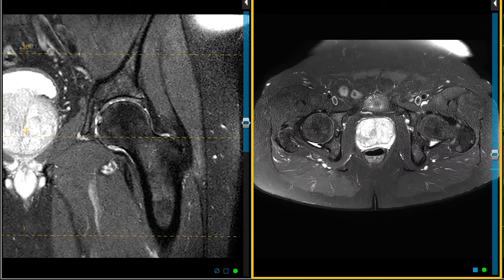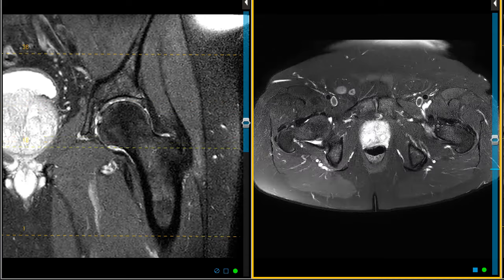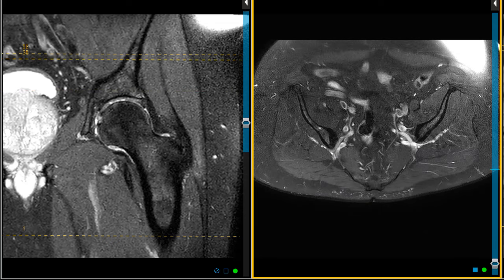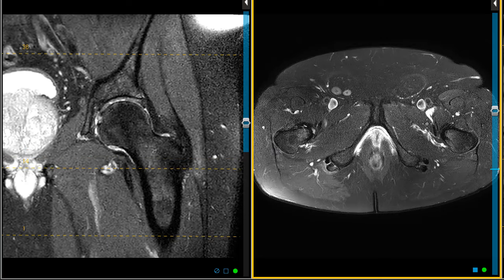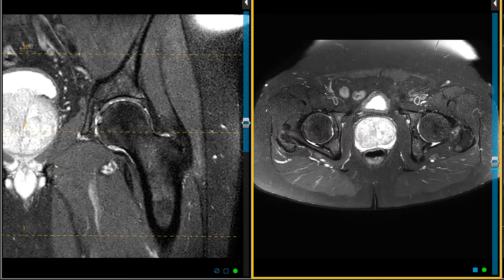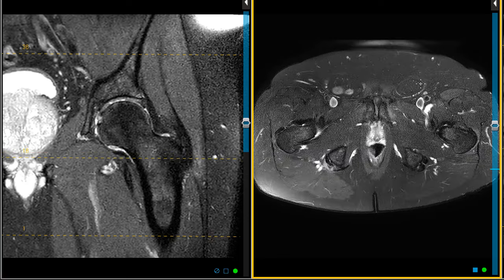He has a few other findings — several other findings actually — and that's common to find multiple other things. He has a fluid collection over here in the front of the pelvis. As we go down lower, right here we see the femoral artery and vein, and there's a little band of brightness here — this is the iliopsoas bursa. He's got a small bursal effusion there.